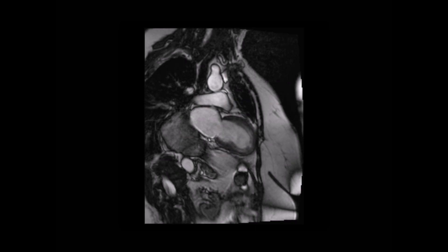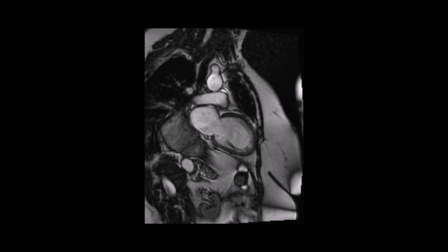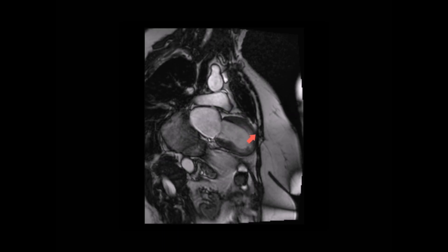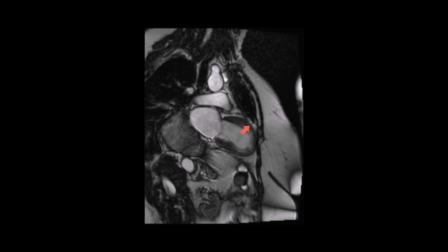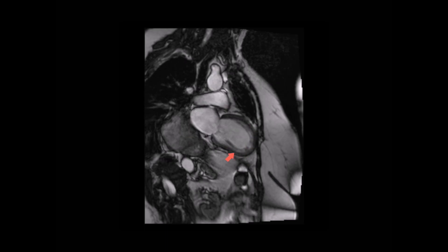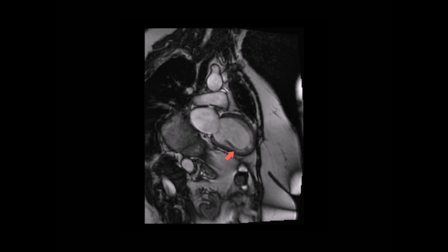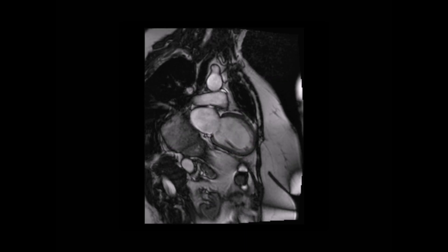Here's a two-chamber cine CMR image showing the left ventricle, mitral valve and left atrium. Again, we can see a degree of ballooning and marked regional wall motion abnormality of the apex in this patient with Takotsubo cardiomyopathy.